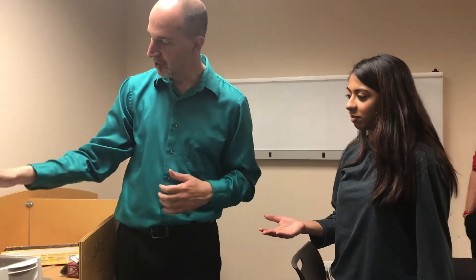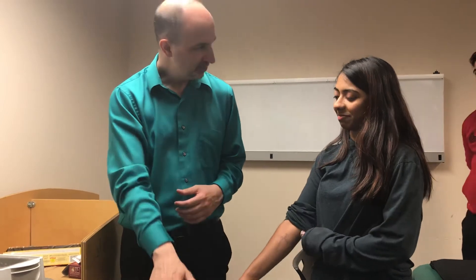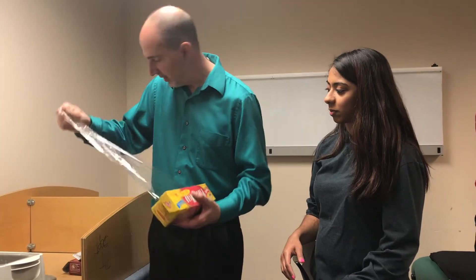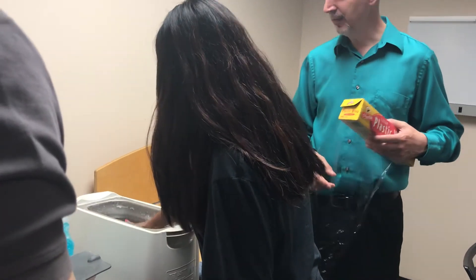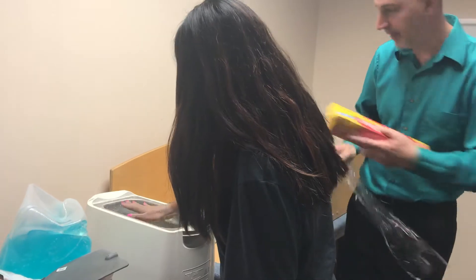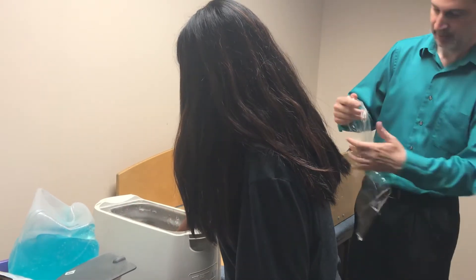So what you're going to do is — without touching the sides, keeping your hand open — put it in, hold it there a second, then pick it up. The first dip is going to seem the hottest, and then each one progressively will seem less hot because you have the layers of wax there. After that it's a two-person job — we need someone with that pink towel. I'm going to cover her with this and then he's going to cover it with that. Eight to ten dips.